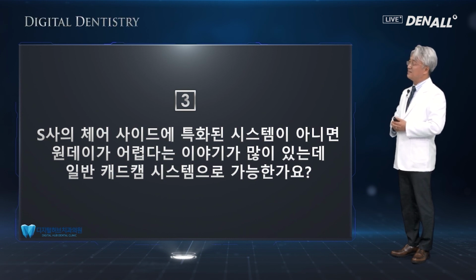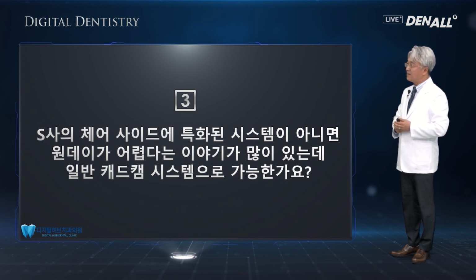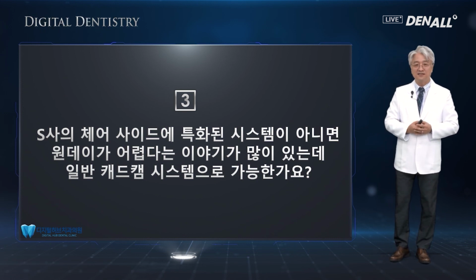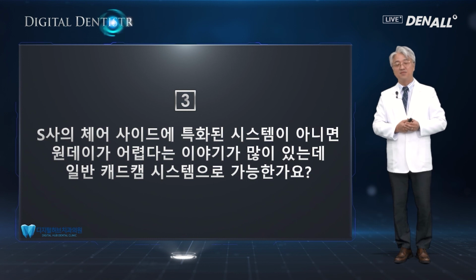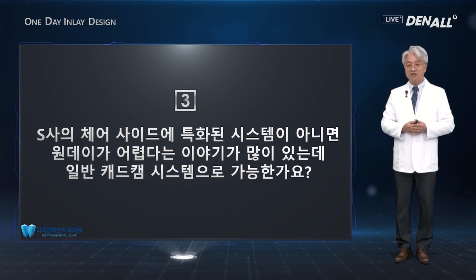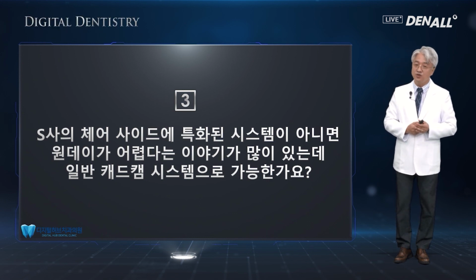So third question, the company has chair-side customized system, and without that system, many say one day would not be possible. Can we use a general CAD/CAM system for one-day approach? Now, I believe this person studied a lot about CAD/CAM system. Yes, it was so up to now. I think what is the companies you are referring to, but their CAD/CAM system has been customized for one-day approach.